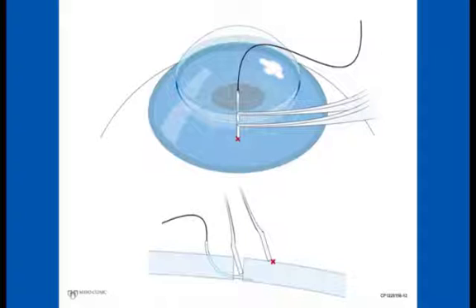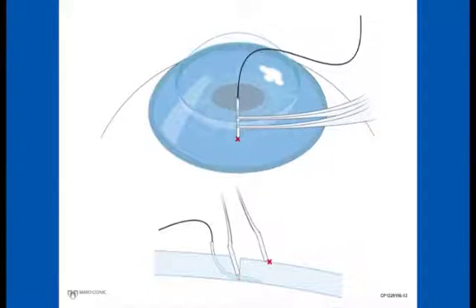We stabilize the host with the two tips of the forceps. The maneuver is the same as we used earlier on the graft side. One tip engages deep down the wound edge and the other engages at a 45 degree angle along the intended radius of passage. Once you have that set up, the needle will drive accurately without any effort because there's nowhere else it can go.